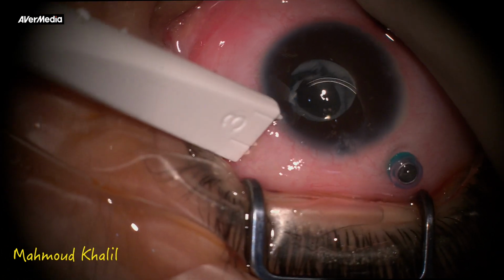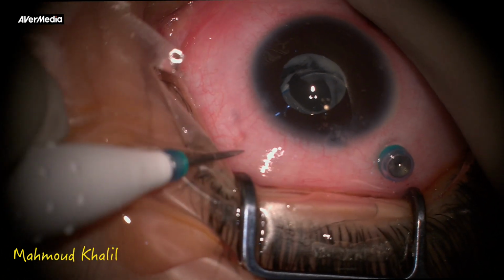Welcome everybody. This case was an 11 years old child who presented with a pseudophakic bullous retinal detachment. Going inside and starting with doing a core vitrectomy.